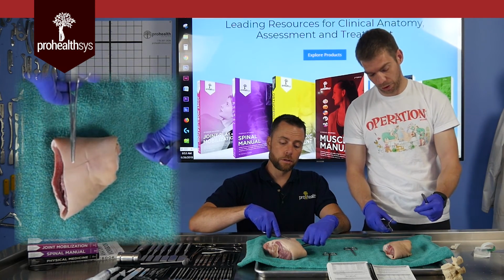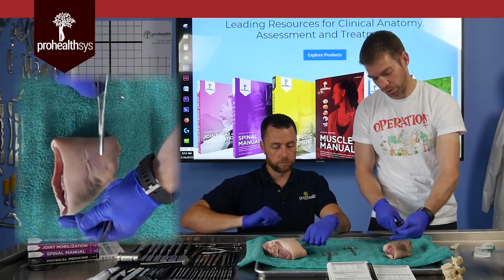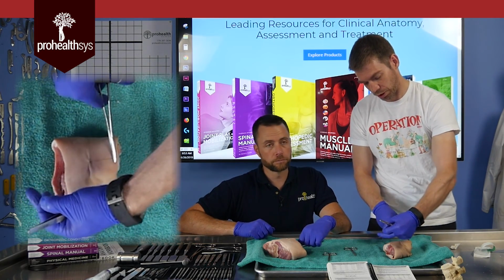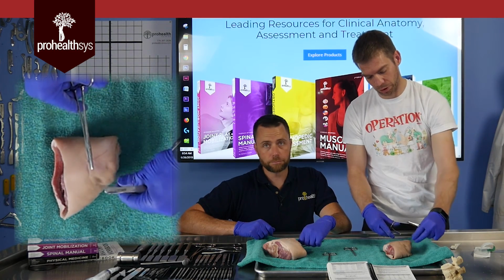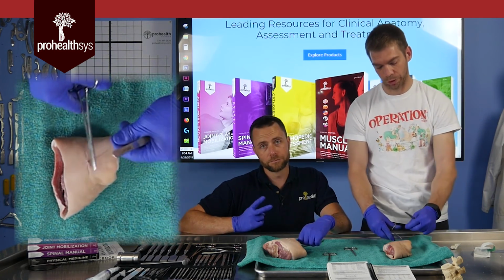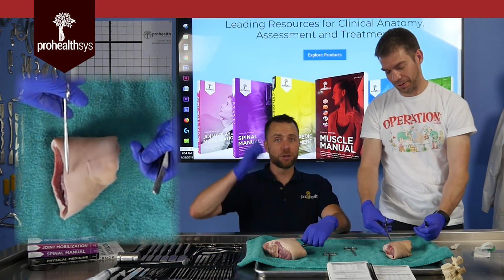So do another couple of throws, loop around, grab the end, pull it through, change direction. I'll usually do 4. Okay, that's a little bit long there. Come back here. There we go. I like 2 or 3 myself. Grab the end.